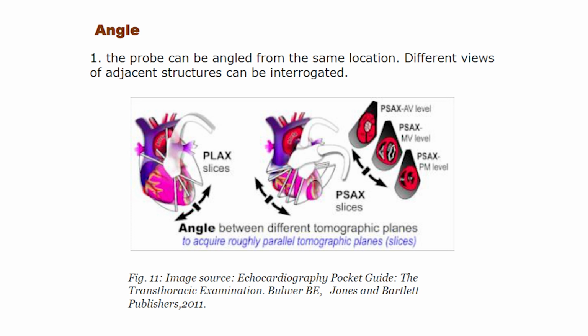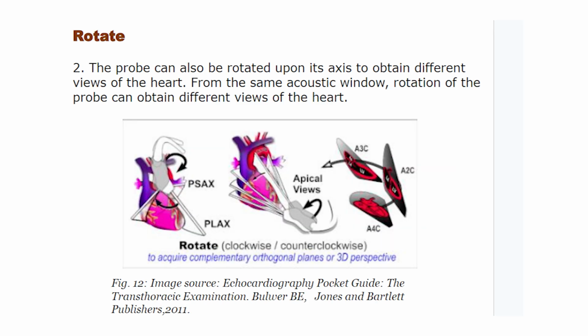Figure 8 shows commercially available linear, curvilinear and phased arrays. Figure 9 shows a linear phased array and illustrates how the ultrasonic beam can be focused in any desired direction by controlling the phase of the applied voltage to individual elements. Figure 10 shows a conventional single transducer versus a phased array consisting of 16 transducers.